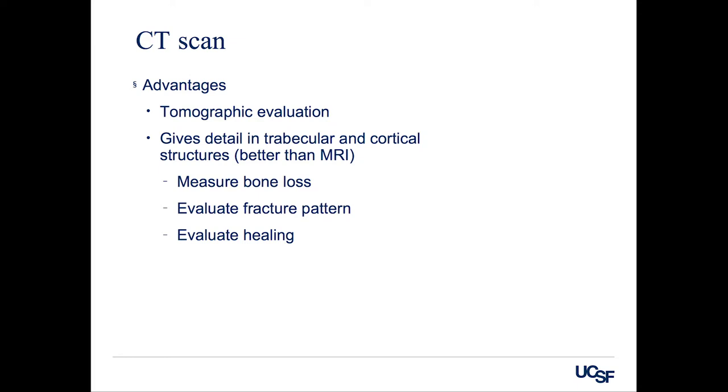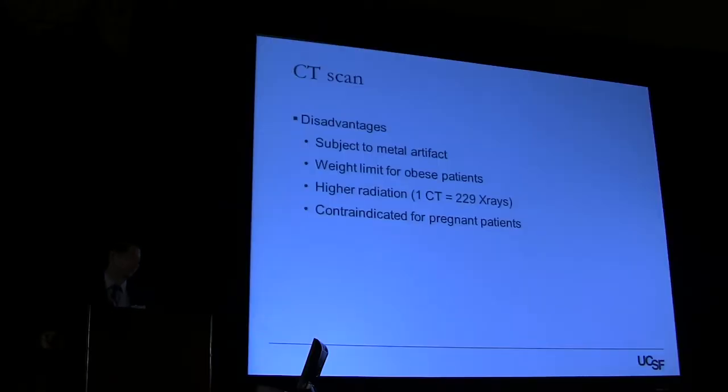And then one CT scan is equivalent to over 200 single x-rays. So that's quite a lot of radiation. So you have to think about who you're using these on, if you're using it on young children, especially young female patients. Okay.